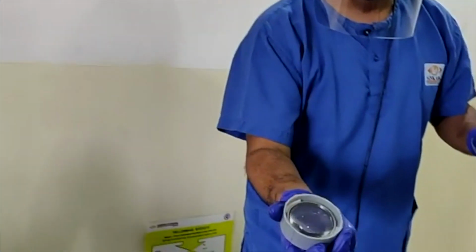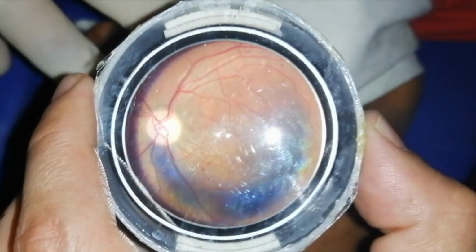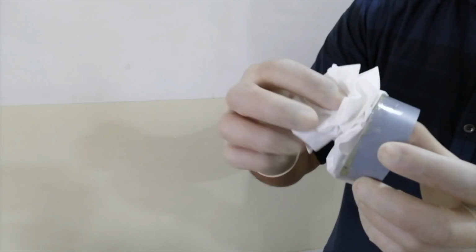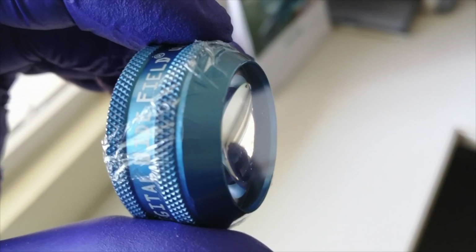Modified lens for the examination. The front surface of the lens is covered with a plastic sheet, preventing the direct contamination of the lens surface. This gives a good view of the fundus with minimal reduction in quality. Clean using the same spray and a clean tissue paper after removing the lens. Now coming to slit lamp biomicroscopy.